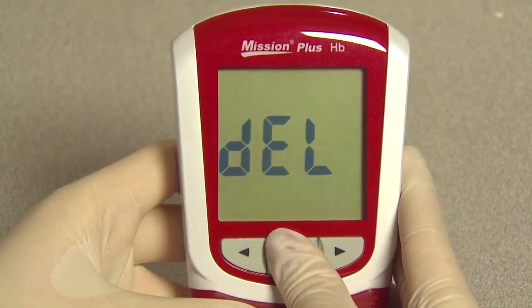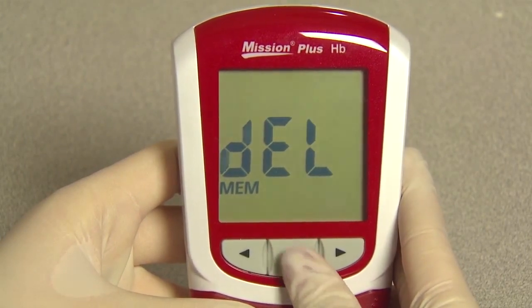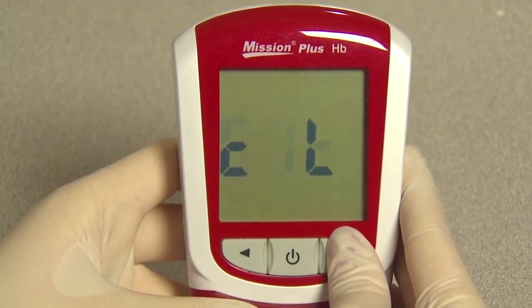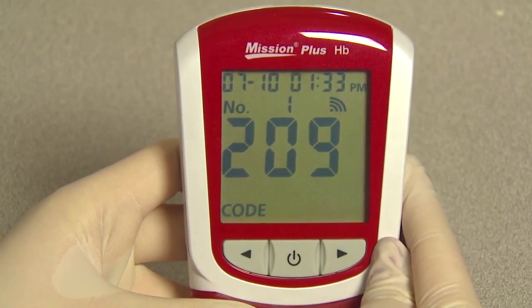Press the power button to enable data deletion. MEM will be displayed. Press the power button to delete all the data in memory. Then the meter returns to the setup menu. Press right or left until ELT is displayed and press the power button to exit the setup menu. Press the power button to turn off the meter.